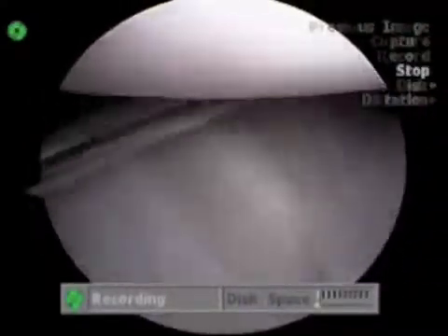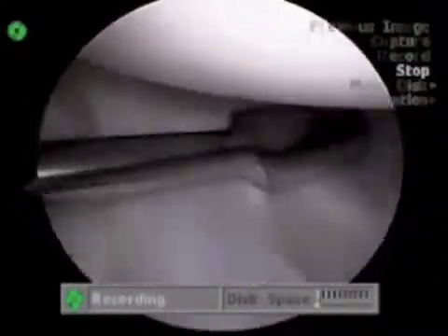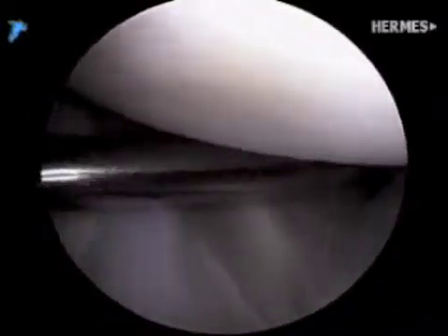Viewing from an anterior superior portal and working through both the anterior inferior and posterior inferior portals, the capsule is thoroughly prepared with the rasp, taking care not to injure the attenuated capsular tissue. This promotes soft tissue scarring and healing.